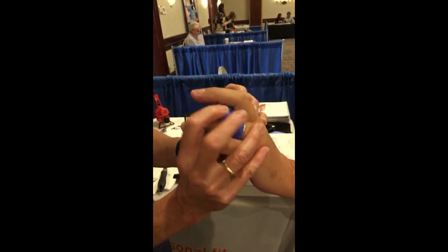This will help heal a sagittal band injury or any kind of inflammation at that MCP joint of the middle finger. If you look at it, that middle finger is more extended than the adjacent fingers. The patient can relax. The sagittal band is relaxed. It can heal. Fabulous. Thank you so much.